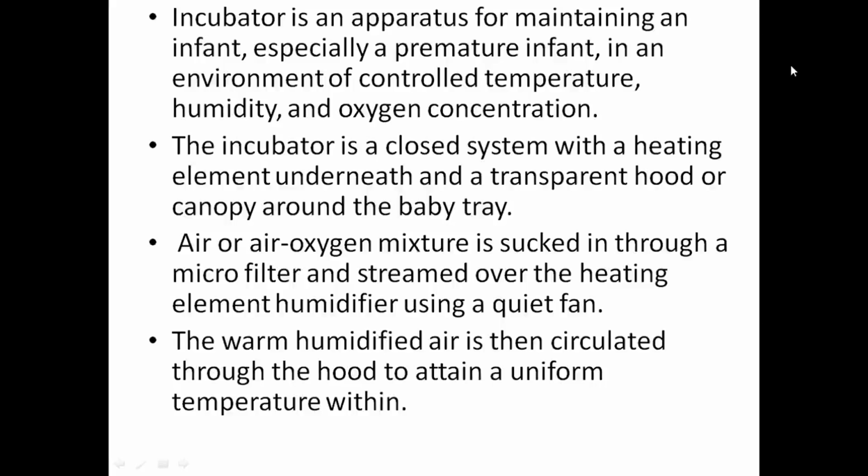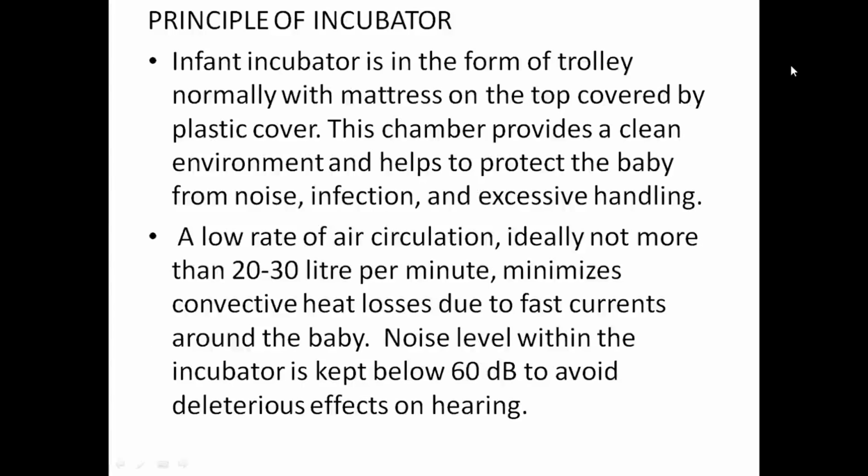Air oxygen mixture is sucked in through a microfilter and streamed over a heating element and humidifier using a quiet fan. The warm humidified air is then circulated through the hood to attain uniform temperature within. The incubator is in the form of a trolley, normally with the mattress on the top covered by a plastic cover. This chamber provides a clean environment and helps to protect the baby from noise, infection and excessive handling.